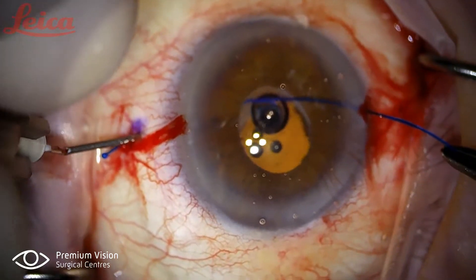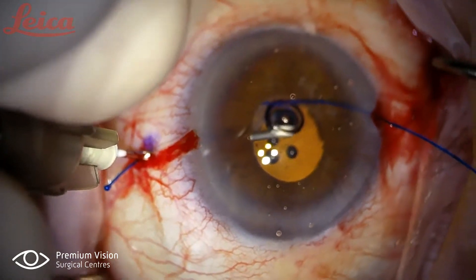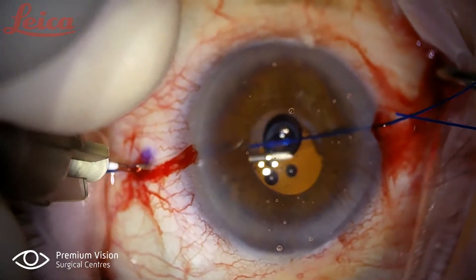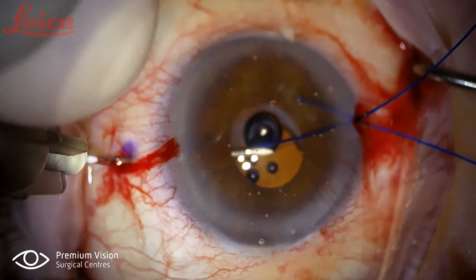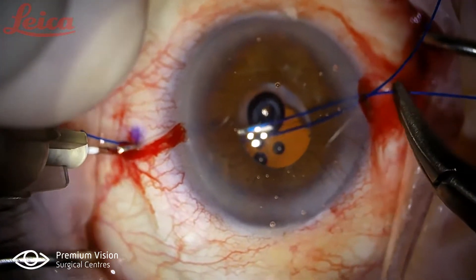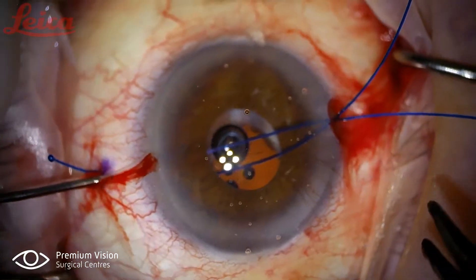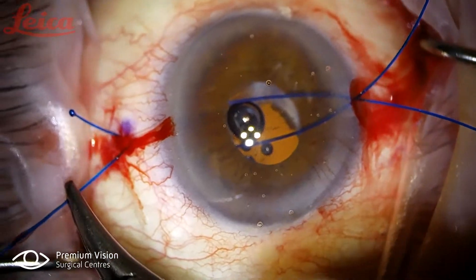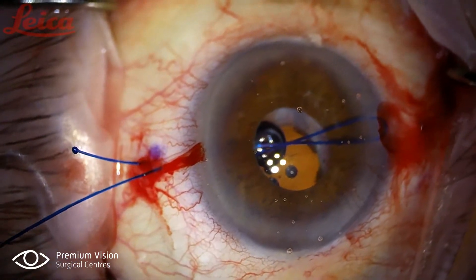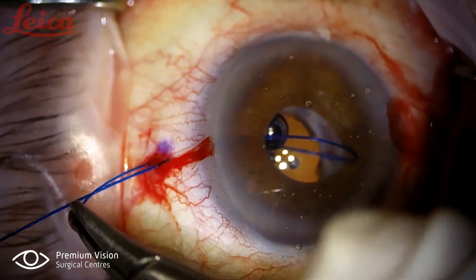I'll go just in front of the first pass, keeping some sclera between the two holes, and this time the direction is behind the pupil toward the center, between the lens and the iris. Once I see the tip of the needle in the pupil, I'll pass the suture. I frequently pre-place the Prolean suture so I don't need to manipulate while the needle is inside — I prefer to pre-place it. Now I'm getting the Prolean suture into the opening of the hub of the needle and pushing it through the core of the needle until it stops at the bent area, then pulling it out. The Prolean is thick so it can make loops and cause damage, so be careful and manipulate the suture gently so it doesn't hit the cornea, iris, or lens.